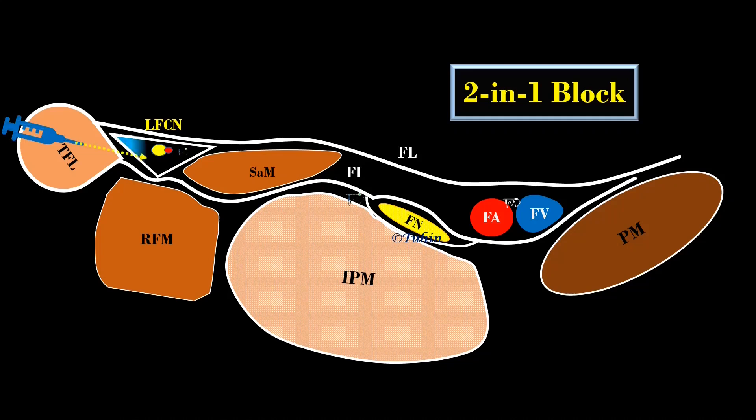The local anesthetic deposited in the infrainguinal fascia iliaca compartment may not block the LFCN. First, we target the LFCN directly, then the needle is advanced and local anesthetic is deposited between the fascia iliaca and the epimysium of the iliopsoas muscle. The local anesthetic will travel medially along the fascia iliaca compartment and block the femoral nerve. Alternatively, you can advance the needle tip just lateral to the femoral nerve and deposit the local anesthetic there.